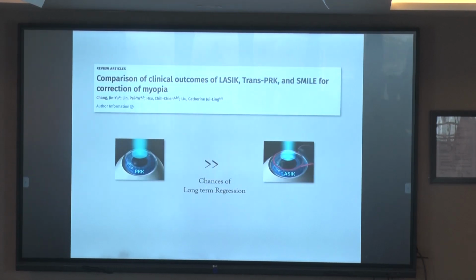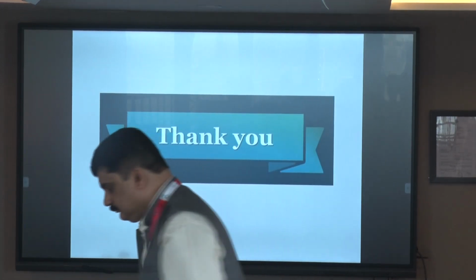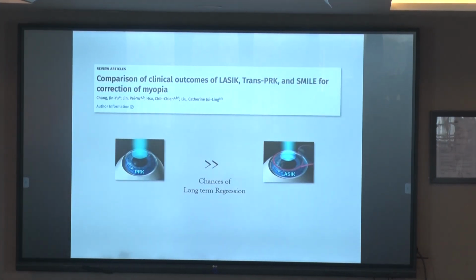Again, clinical comparisons of LASIK, trans PRK, and SMILE for correction of myopia show that the chances of long-term regression are much higher in PRK as compared to the other refractive procedures. So this would be my other point. A few points which Dr. Mazz mentioned, which I would like to take on.